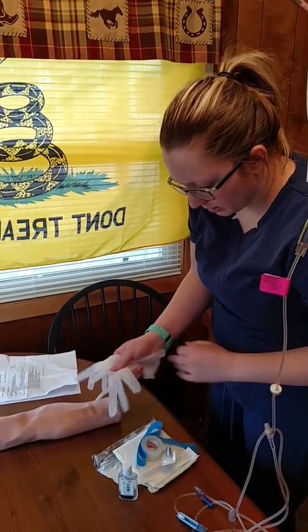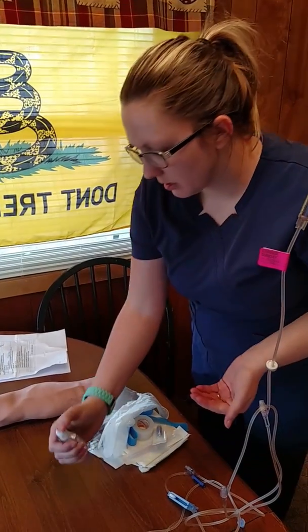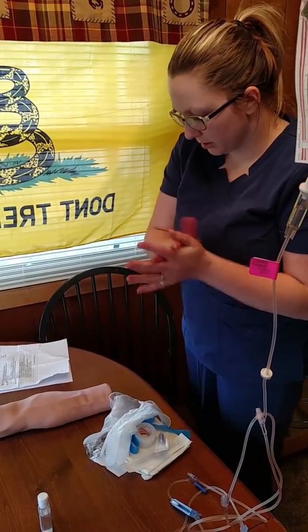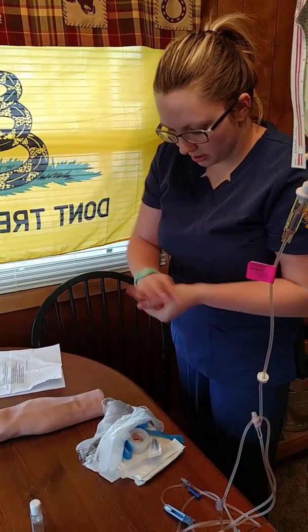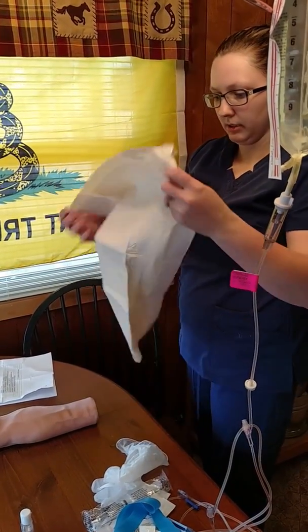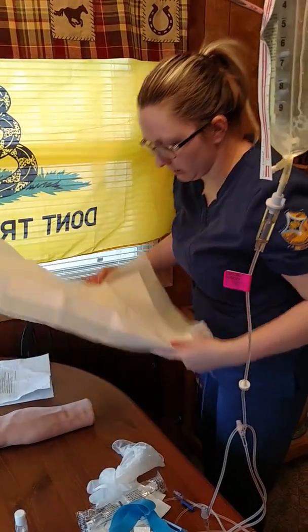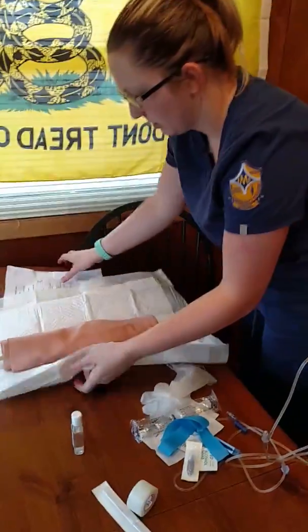All right, so I'm going to wash my hands here. And first I want to set up a pad underneath so if there's a little blood loss there, we don't drip it all over the bed and the clothes.